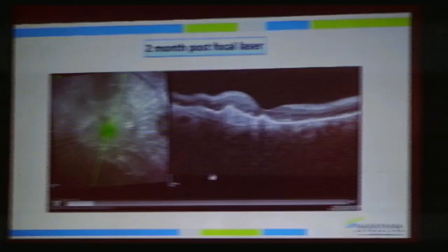I think I should congratulate you and the patient. Actually, this was a real lot of ups and downs, and still the patient is continuing to come for treatment with you. That's really lucky. Yes. So the problem was actually the advancing edge of the BVN, and the polyps were just going on.